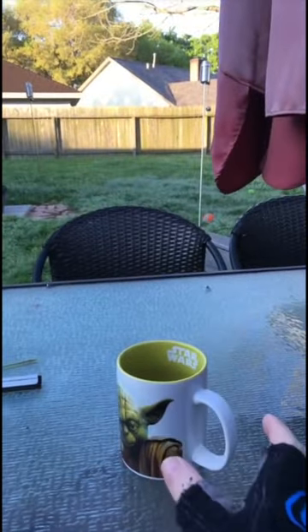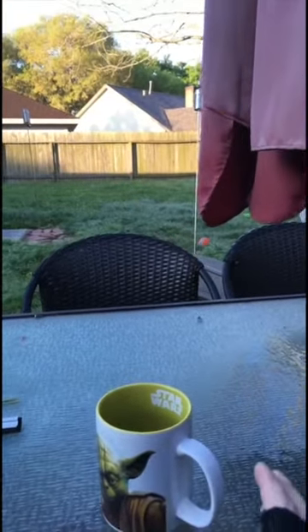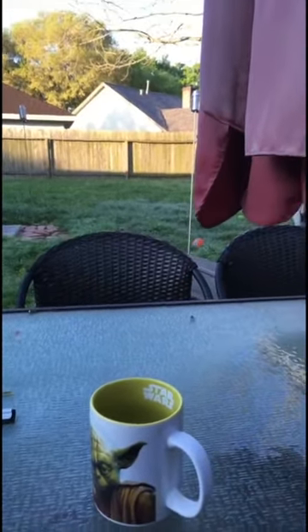For instance, if I'm going to reach for this mug, even the motion of my body like that can cause the wheelchair to move if the wheels are not locked. If the wheelchair moves and you're not causing it to move, there's a problem. That's not good. You're going to crash into something, you're going to spill your coffee, you're going to hurt yourself. So you got to put on the brakes.